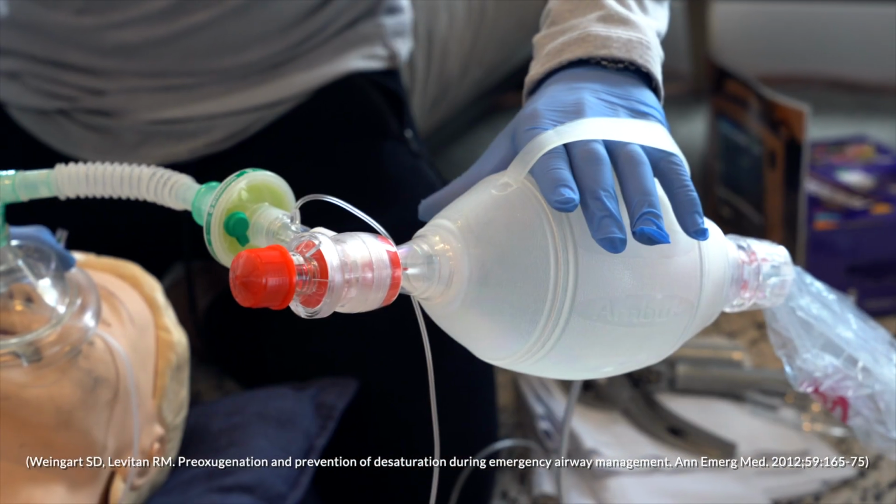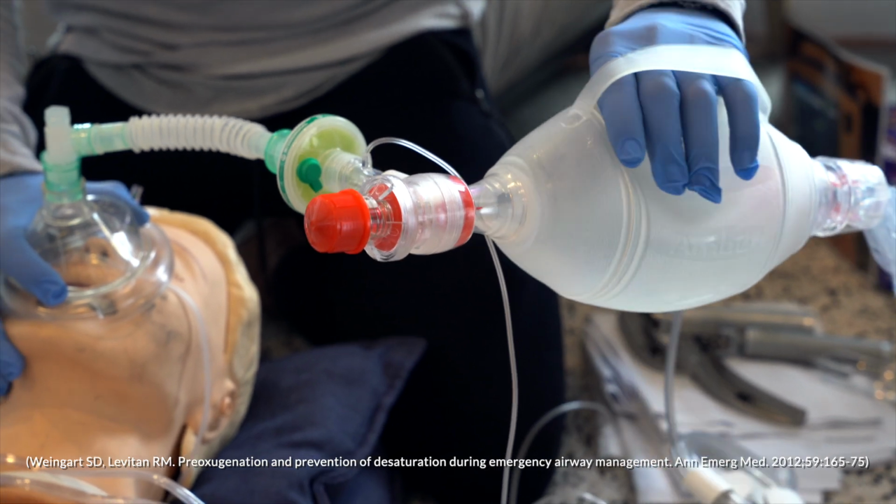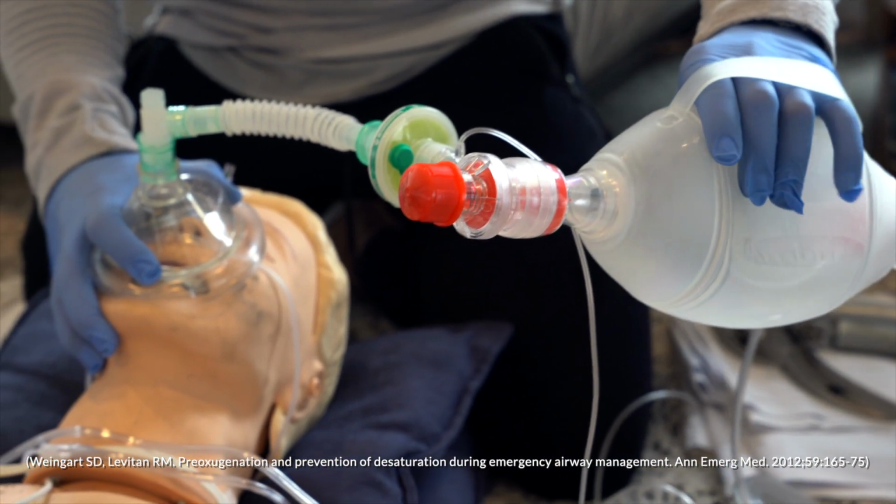Also, if a second source of O2 is available, nasal prongs at 15 litres a minute should also be applied early and left on during the intubation attempt. This is referred to as apneic oxygenation and has been demonstrated to prolong safe apnea time. In terms of how long pre-oxygenation should occur for, evidence suggests that at least 3 minutes worth of tidal volume breathing or assisted ventilation with a high FiO2 source should provide close to maximal denitrogenation.